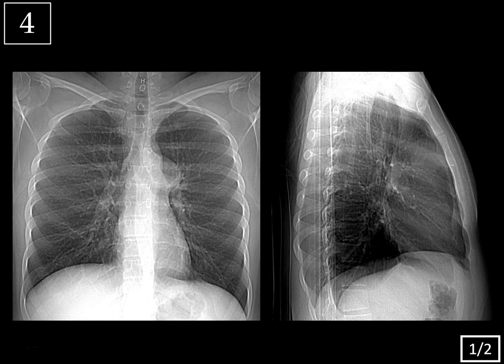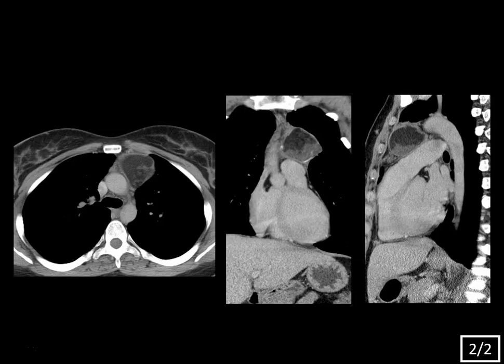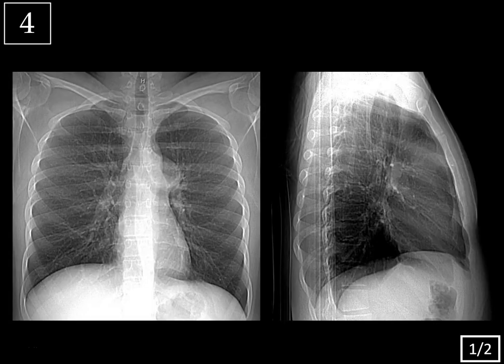Case four, slide one of two. On frontal and lateral views of the chest, there's a mass in the left suprahilar region on the frontal view, which is in the anterior superior mediastinum on the lateral view. When you have an anterior superior mediastinal mass, you can think of the five T's for your differential diagnosis: could this originate from the thymus — like a thymic cyst, thymoma, thymic carcinoma, or thymolipoma?